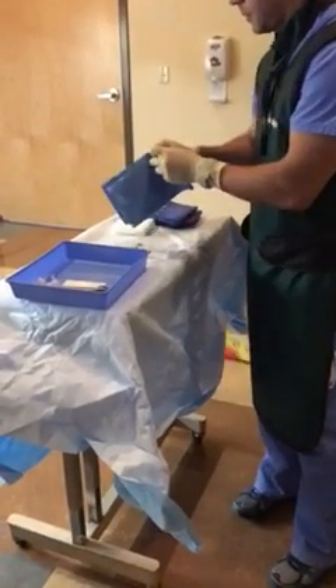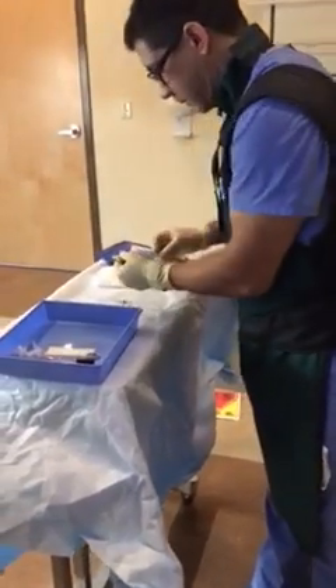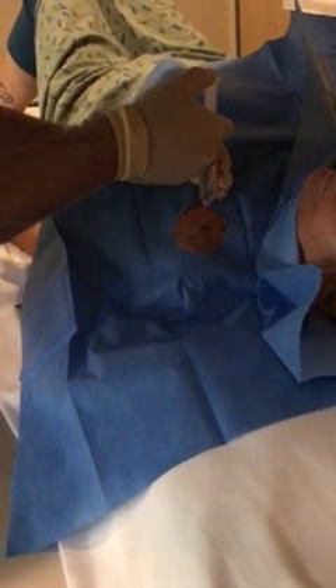We're going to get the skin cleaned off here with a little bit of betadine, put our sterile drape in place, and then we'll get this numbed up. A little sting and a burn here — a little poke. You're going to feel just a little burning as we go down.